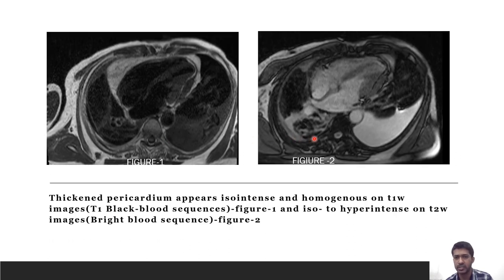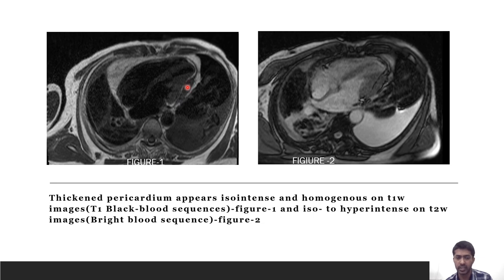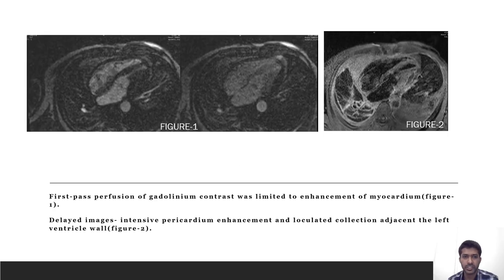These are the black-blood images and the bright blood images. On the black-blood images, there is generalized thickening of the pericardium and the loculated collection along the left ventricle cavity, which appears T1 iso-intense and T2 hyperintense relative to the myocardium. Post-injection first-pass perfusion images show enhancement of the myocardium; however, no enhancement of the pericardium or the collection is noted.